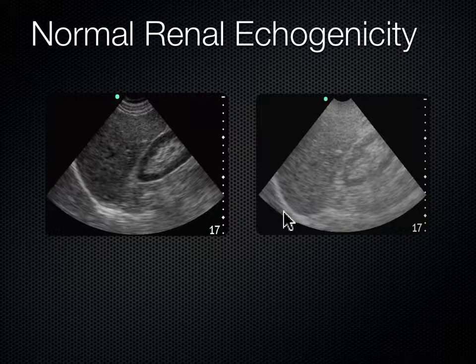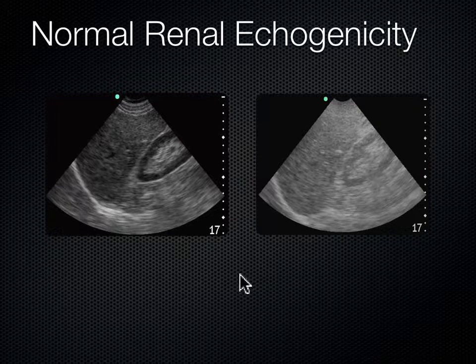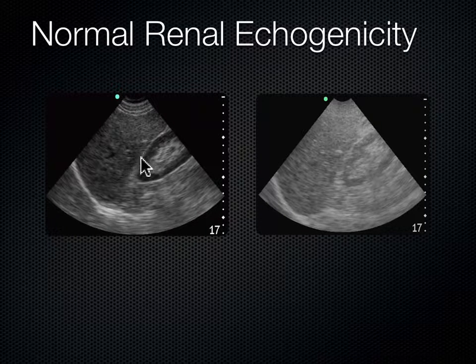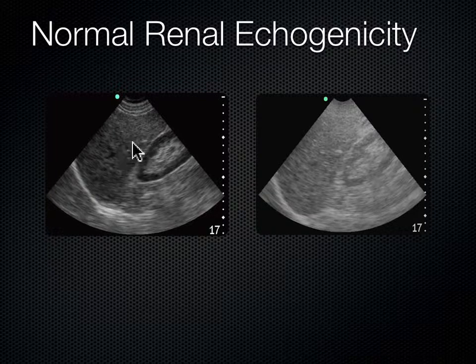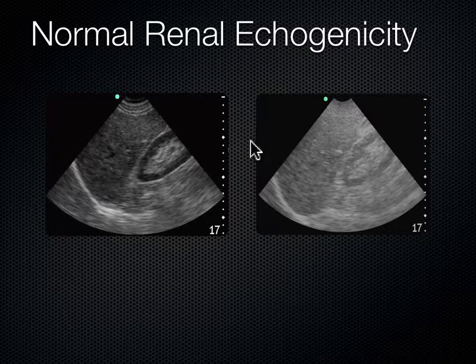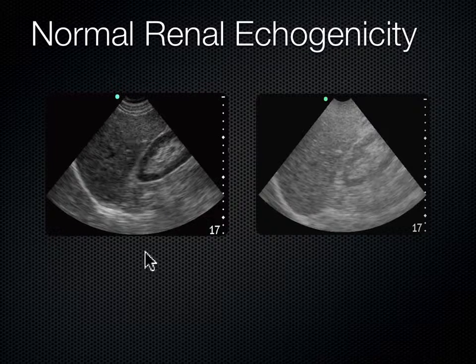If you look at these two images, they both range down to 17 centimeters in depth, but the difference is the gain. The right image here is over-gained—pretty washed out—whereas the left image shows the cortex of the kidney as slightly darker than the liver. If you can make out those subtleties, you've got your gain adjusted just right. That's the art of gain. I know I've got my gain set right when my kidney's cortex looks darker than my liver or spleen.